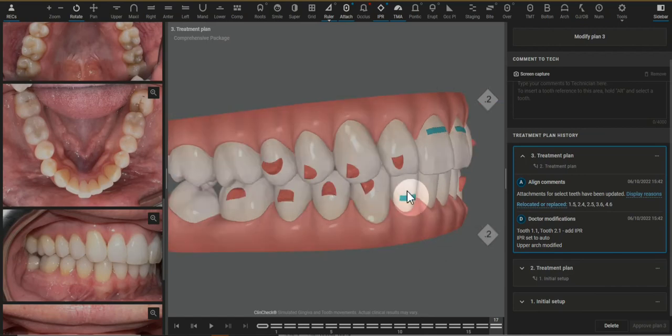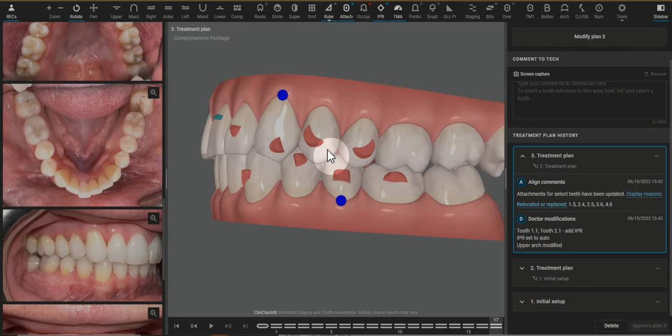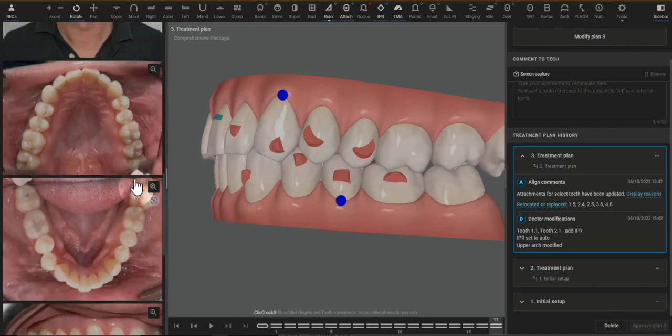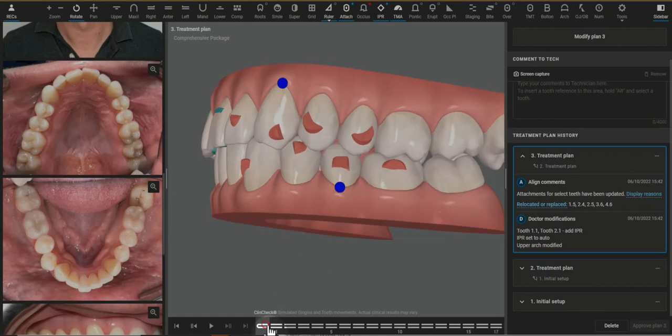Then looking forward, this gives me concern — I see these premolars rotating, but looking at his initial photos, I really don't think they need to, and that's what's probably triggering this lower premolar to need to be intruded as well.